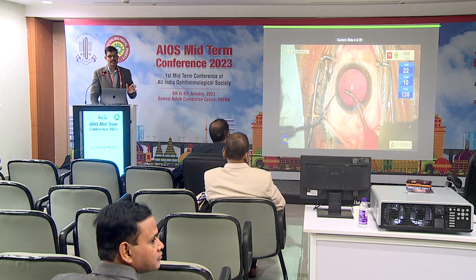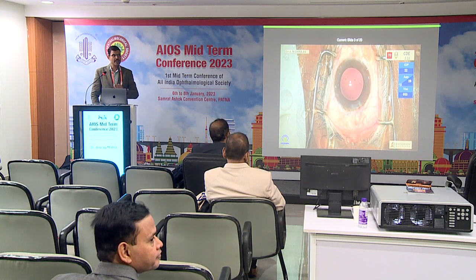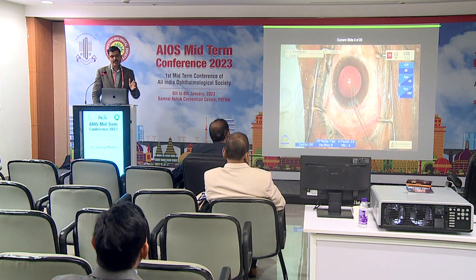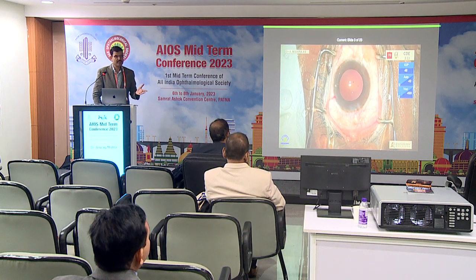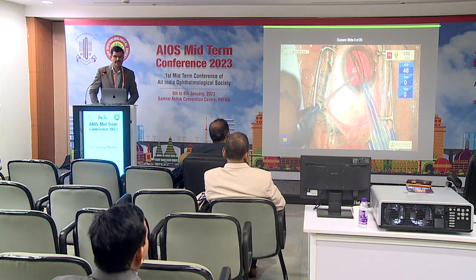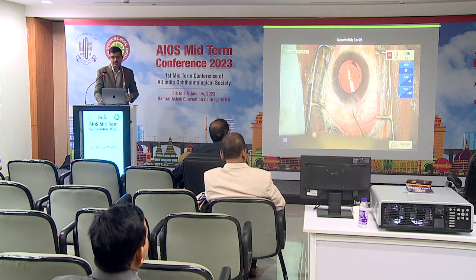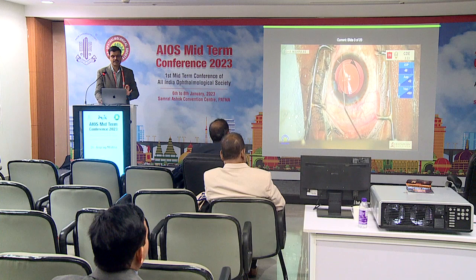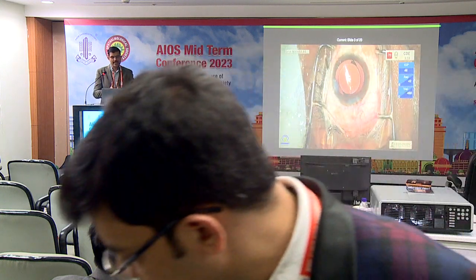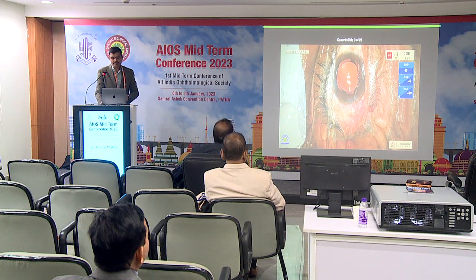I've really started doing many more numbers, and even if the list is really very long, I don't spend more than 5 to 5.5 hours in the OT on any day. I don't have to, because the per unit disposal time from the OT is that much less. So this is about a routine case which finished off, and till the end of it you can see how brilliantly the red glow is appearing.